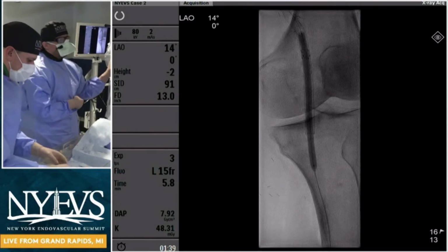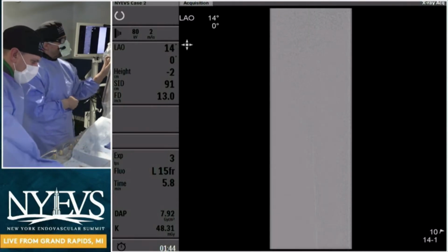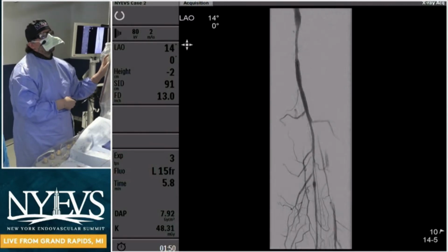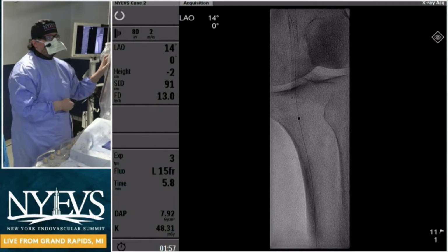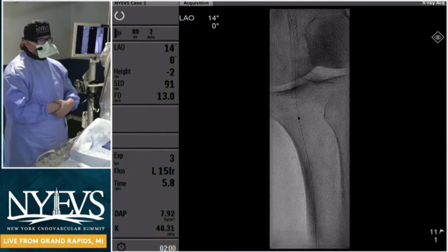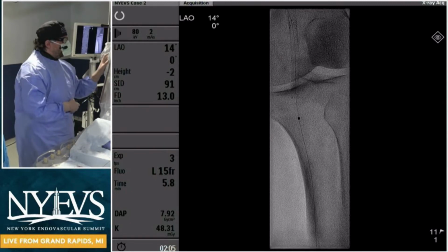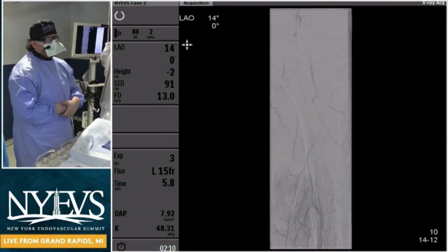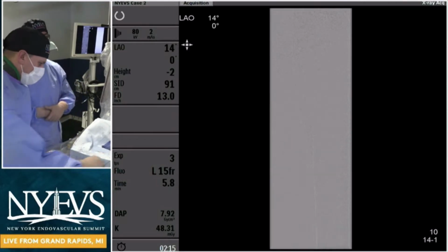Yeah, so we actually performed laser atherectomy using a 1.7 millimeter device. This is after a 2.5 millimeter balloon within the ISR area there. I just didn't want to work in a static situation. And this is the 1.7. I usually will put it on maximum setting, 60, 80, and especially if you have ISR, let it work there. One really refreshing thing here, this image here, I don't know if anybody can pick up on that. You guys see to the right of the screen, that's the anterior tibial artery.